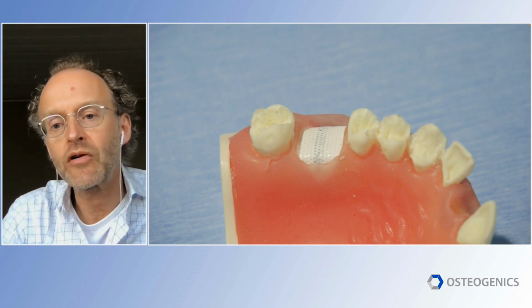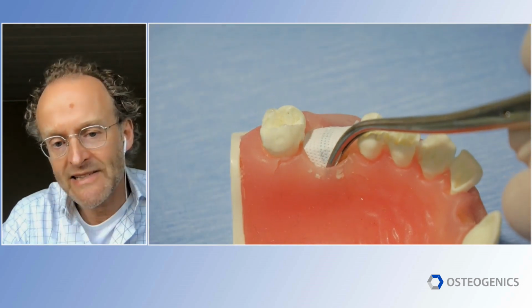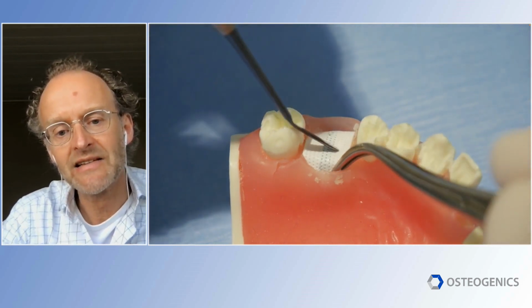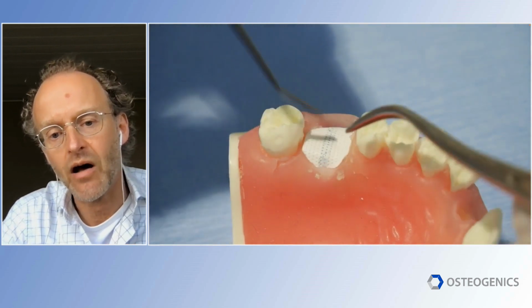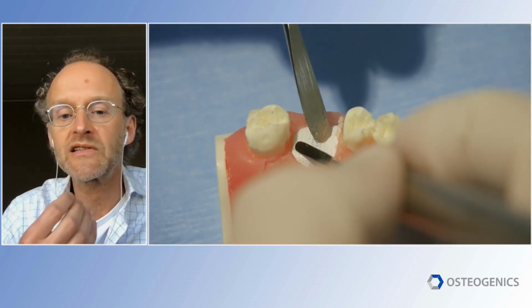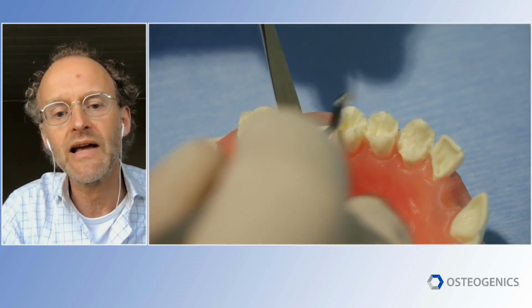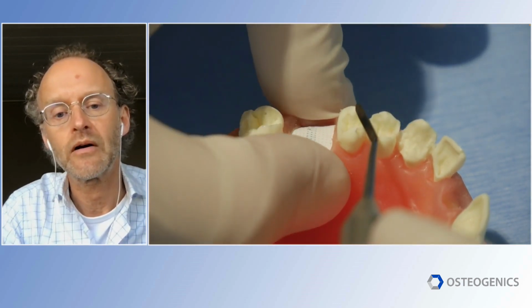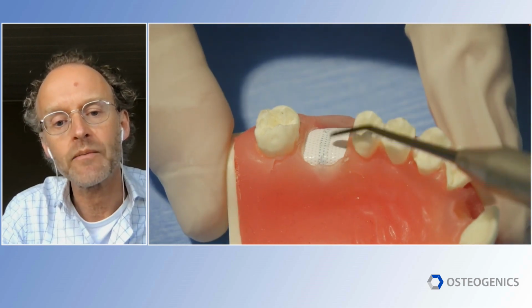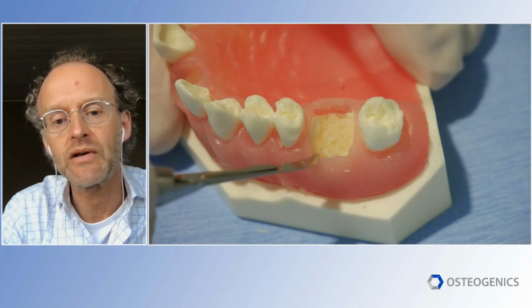And because this is a very important detail, I will show this part again. As you can see, we place it in. We use the instrument to push it down. And on the mesial side, it's already easily under the papilla, but on the mesial side of the molar, we have to push down the membrane a little bit, and because it's more rigid than the non-reinforced one, it bounces back underneath the papilla, and that's really handy about this membrane. Again, push in the square U-form shape that is really stable. And if you look at the membrane now, and you push on it, you can see, even on this model, it's quite stable. But the edges should be covered.